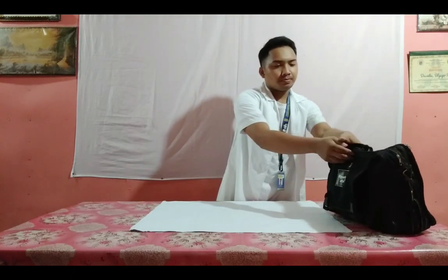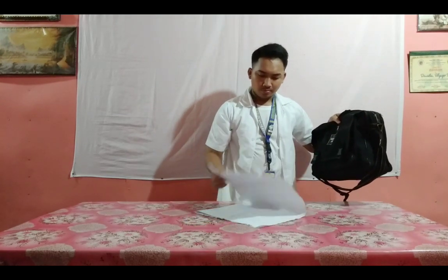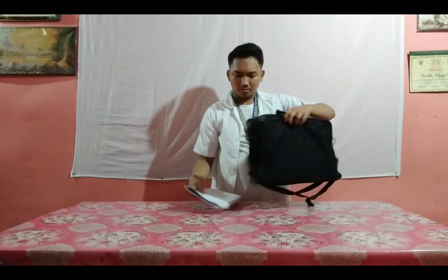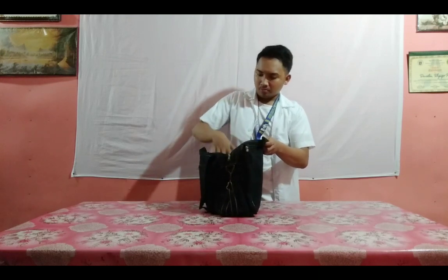Now hold the bag with one hand, and with the other hand, fold the paper lining, contaminated part in, and place over the plastic lining. Now close the bag.